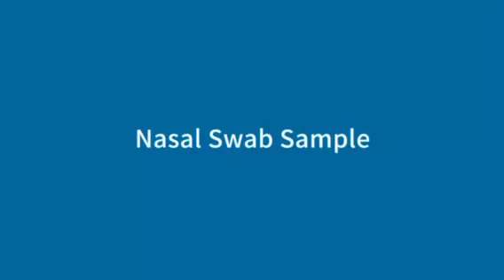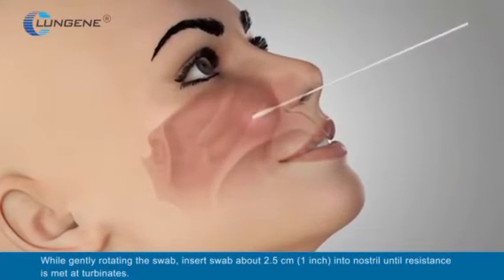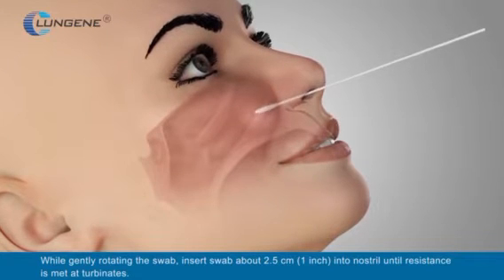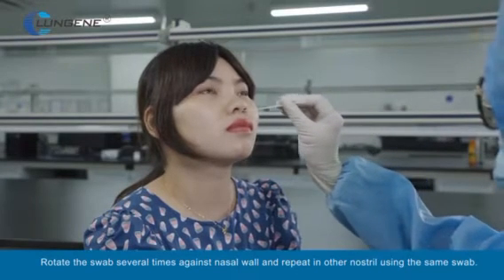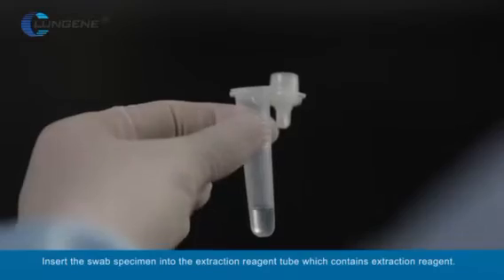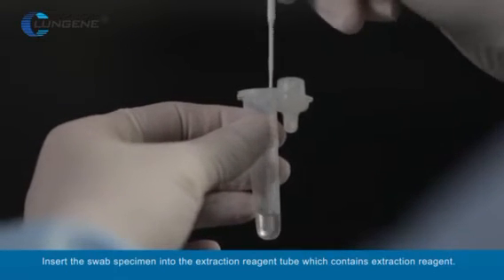Nasal swab sample. While gently rotating the swab, insert swab about 2.5 centimeters, 1 inch, into nostril until resistance is met at the turbinates. Rotate the swab several times against the nasal wall and repeat in other nostril using the same swab. Insert the swab specimen into the extraction tube, which contains extraction reagent.